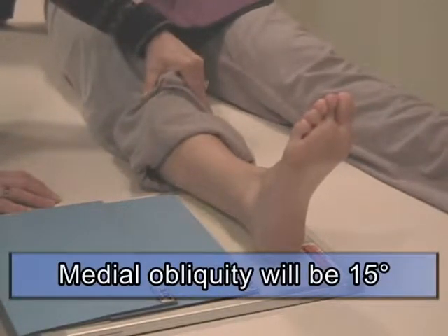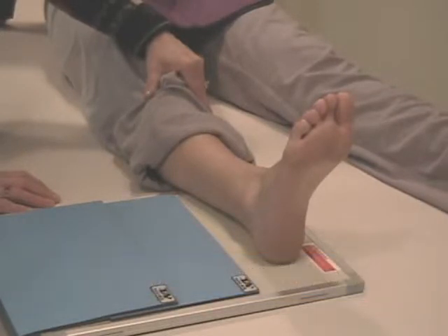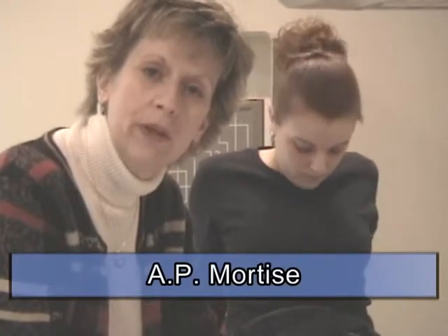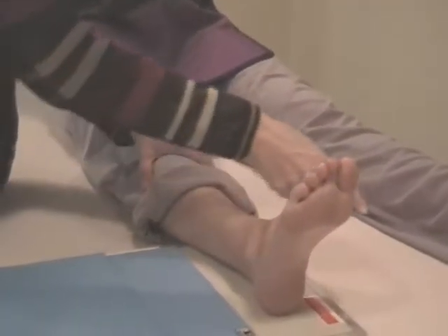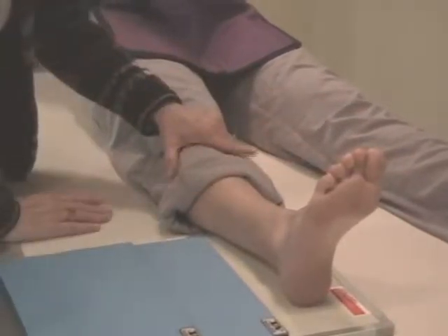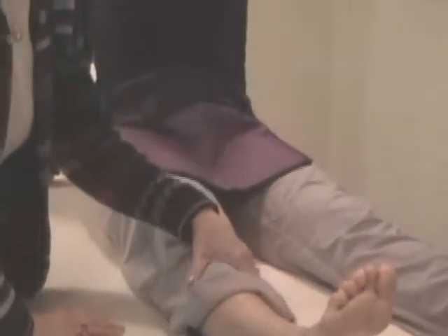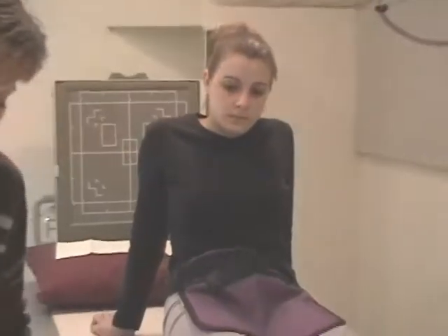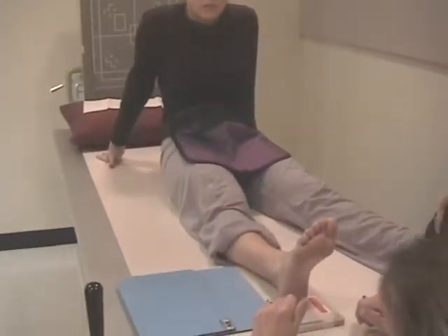We're going to get more precise in a second because I'm going to look at the intermalleolar line. This is actually called an AP mortise. The mortise joint will be opened up on this one. The mortise joint is the 3 surfaces up through the fibula, across the talus, and down into the tibia. This entire joint space, all the way across the ankle, will be opened if you have a properly positioned medial oblique ankle. I'm going to come over here, and what I mean is properly oblique, approximately 15 degrees.